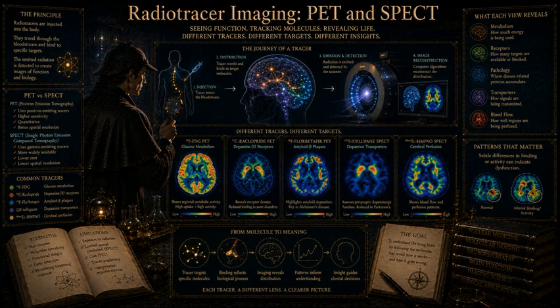Okay, we have transduced the signal. We have one single electron. Still not exactly a surge of power. No, but then we use voltage to create an avalanche.